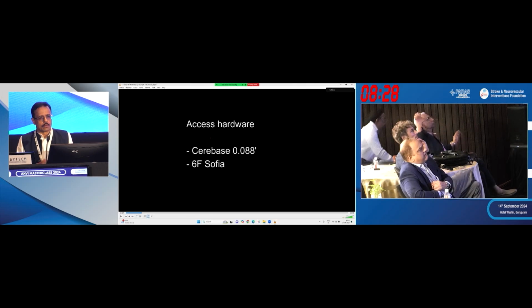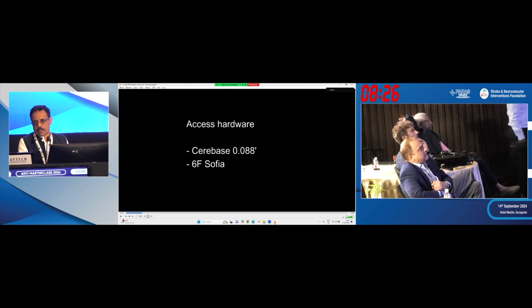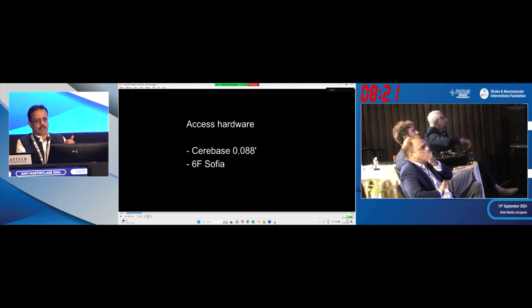So clearly in this case, coming to the ICAD, all right? So ICAD, as I mentioned, we do a thrombectomy one pass first. First is suspicion of ICAD, because straight away the strategy changes. You have to be ready to get a guiding up. First pass with a Solitaire. Literature says stent and injectable agents have the best patency. But again, as I said, maybe our patients come in late and everything. We try with the angioplasty and injectable agents first.